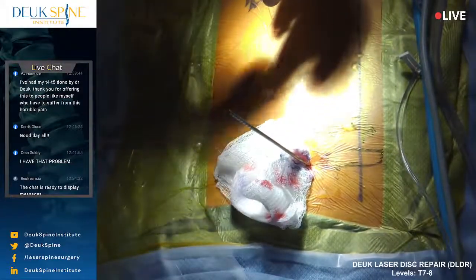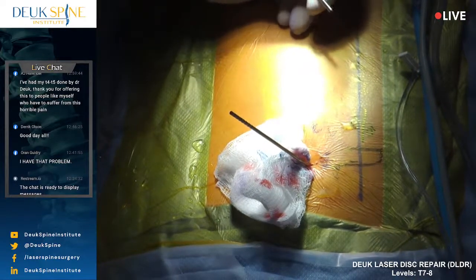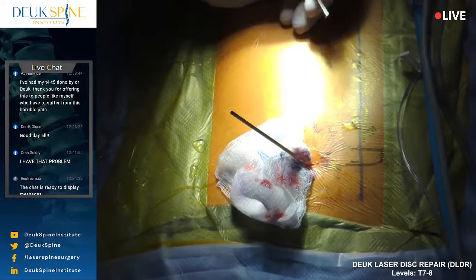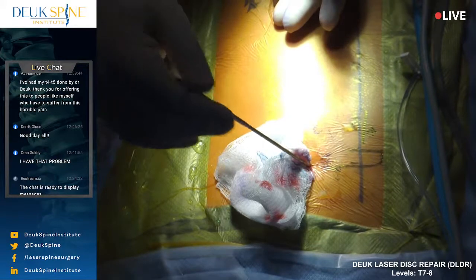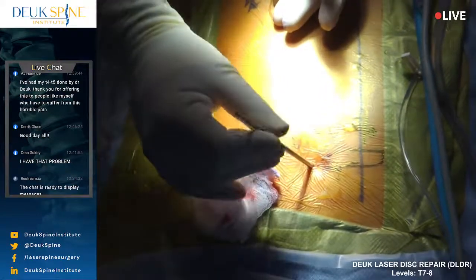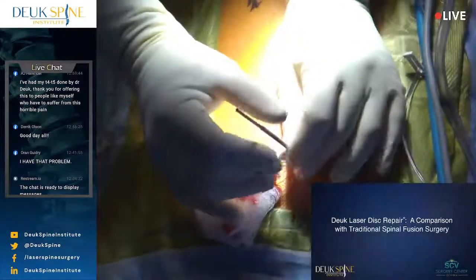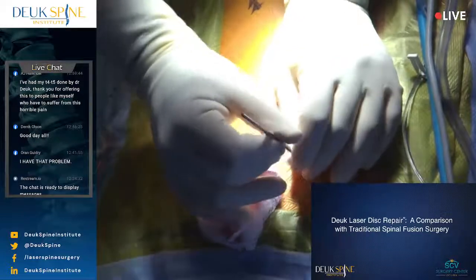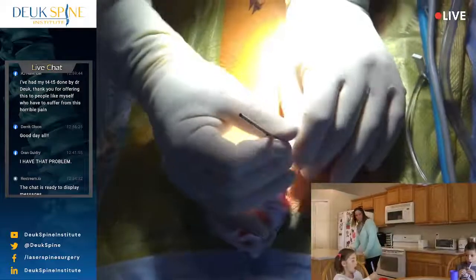Diego, why don't you show our audience the Deuk laser disc repair video on how we do a posterior lumbar. It would be the lumbar one, not the cervical one. How we go in through the back, transforaminal. You're watching the first place in the world to do this. And again, we did this 2 years ago on our first patient. We've done, this is number 12, I believe, and we've had 100% pain relief in that area on every single one of these patients.